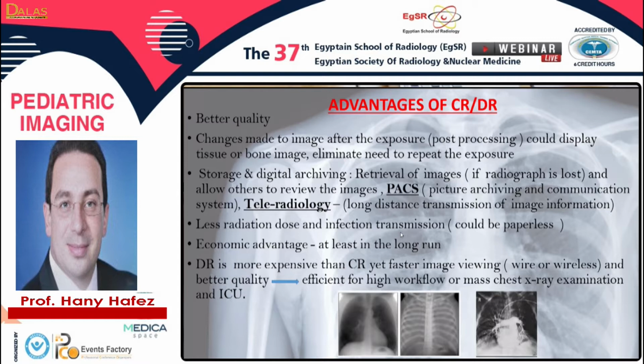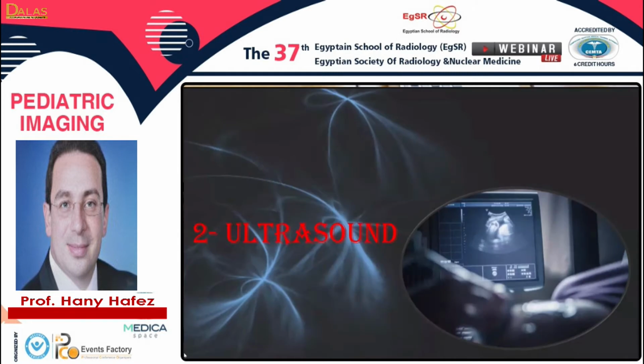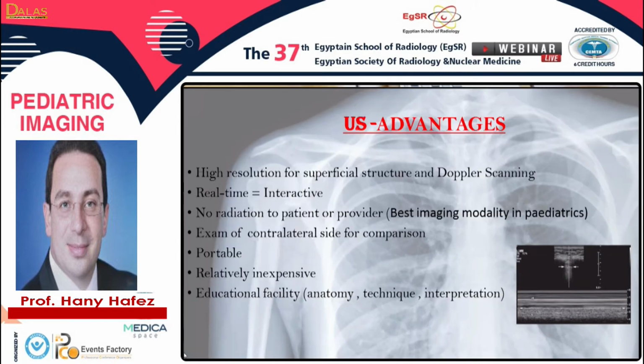DR is more expensive than CR, yet it is a faster imaging viewer, thus efficient for high workflow or mass chest examination and ICU.